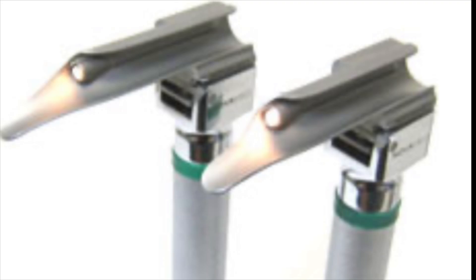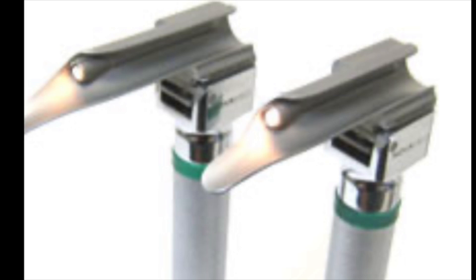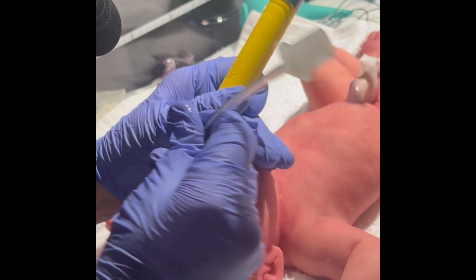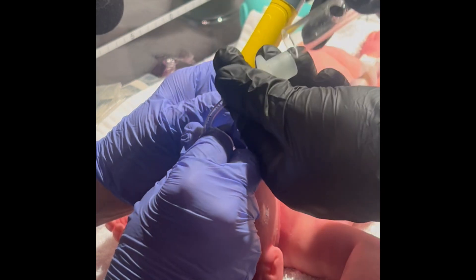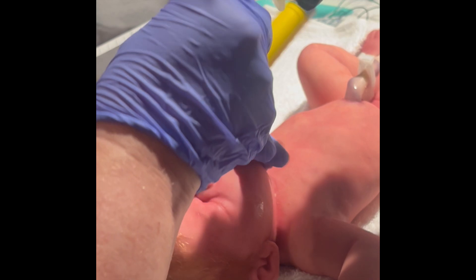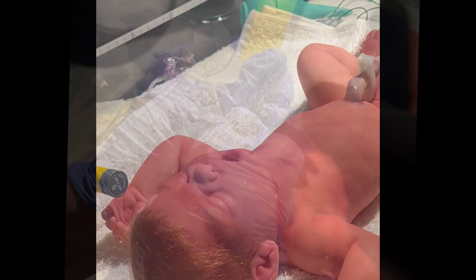You'll also need the proper size ET tubes, as well as a laryngoscope blade. Once you have quickly prepared your equipment and supplies, you will then visualize the cords, pass the cords, place the meconium aspirator on, and then suction as you pull out the ET tube.